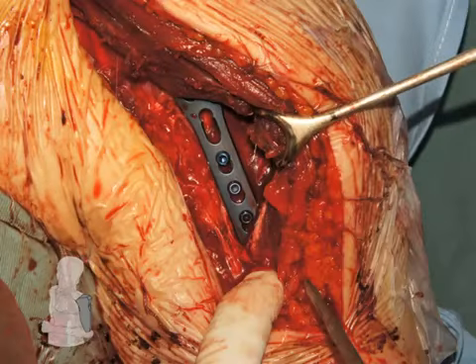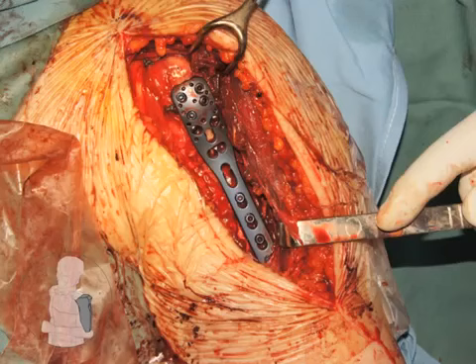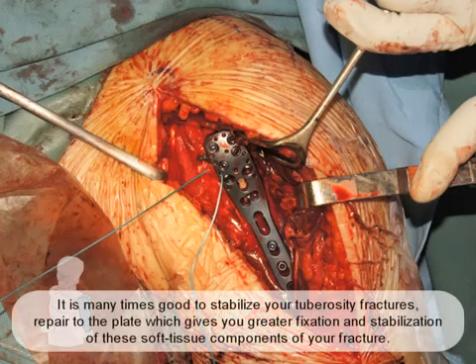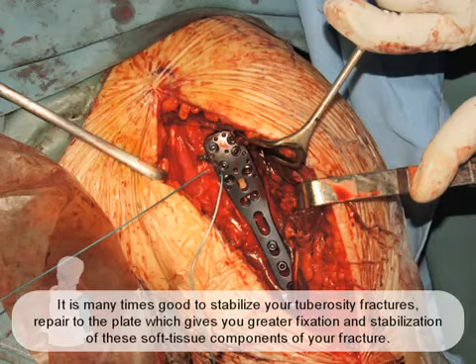Further soft tissue repair through holes in the plate is indicated at this point if further stabilization is necessary. It's many times good to stabilize your tuberosity fractures by repairing them to the plate, which gives you your greatest fixation and stabilization of these soft tissue components of your fracture.